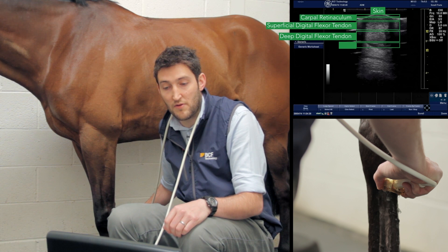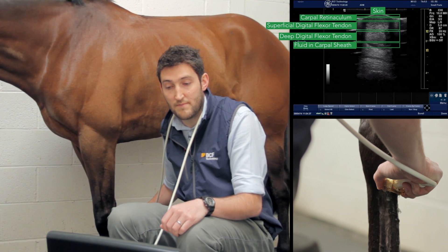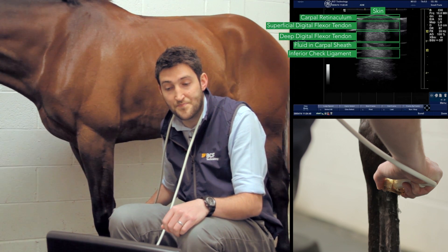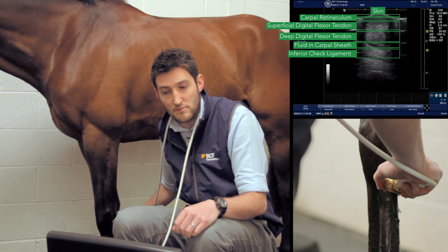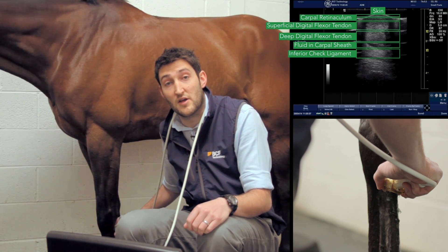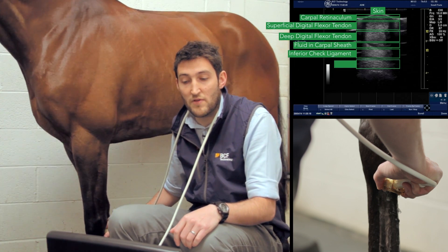Immediately below the deep digital flexor tendon is a black wedge or triangle representing a small amount of fluid in the remnants of the carpal sheath — the distal part of the carpal sheath. Below that is a roughly rectangular structure: the inferior check ligament, or accessory ligament of the deep digital flexor tendon. Its fibers look slightly different because the structure runs obliquely from its dorsal attachment proximally to its palmar attachment distally.